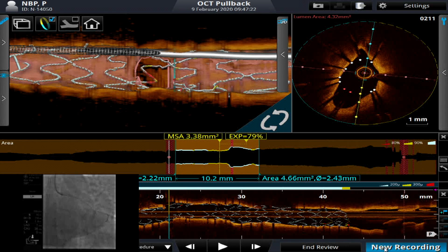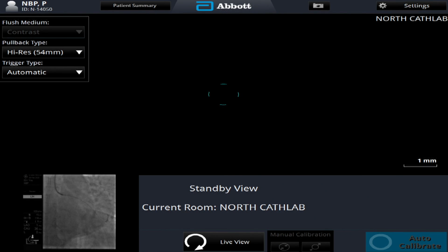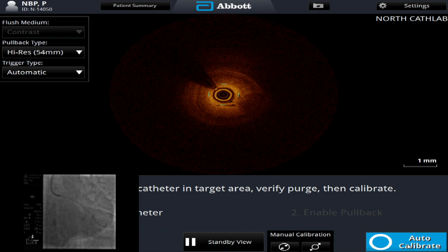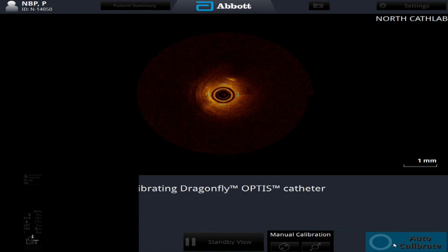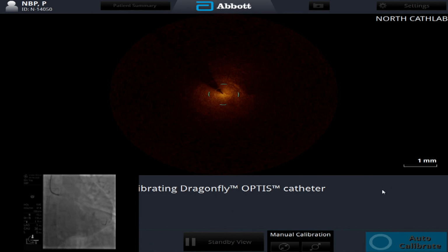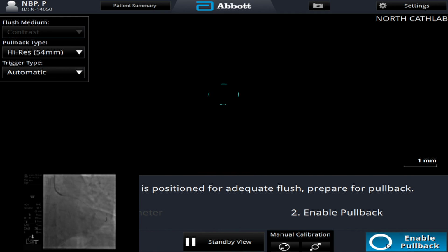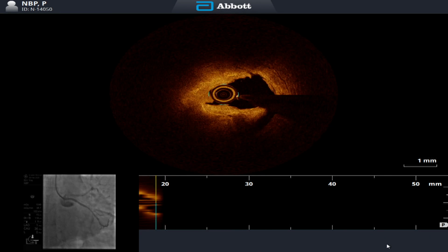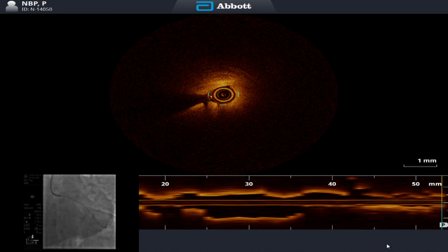Yes, we try to see the new OCT image. Check it, right? Okay, wait a moment. That's fantastic.